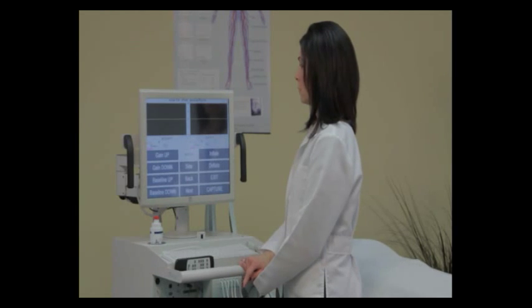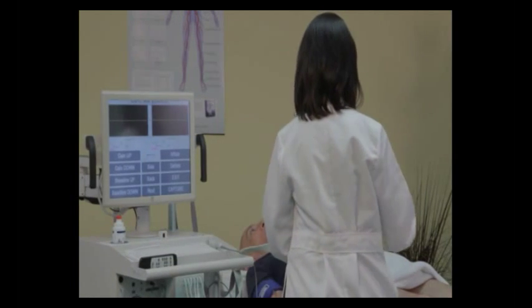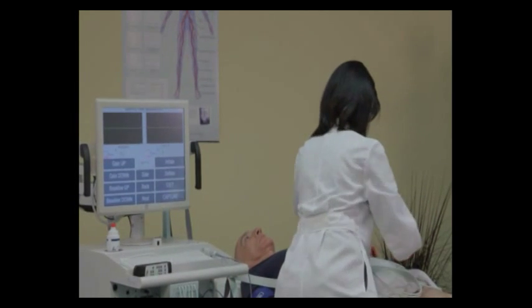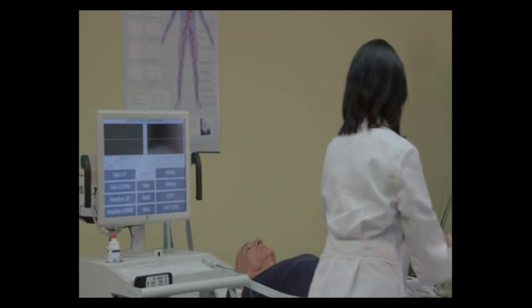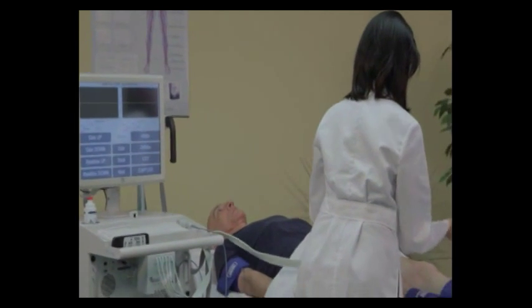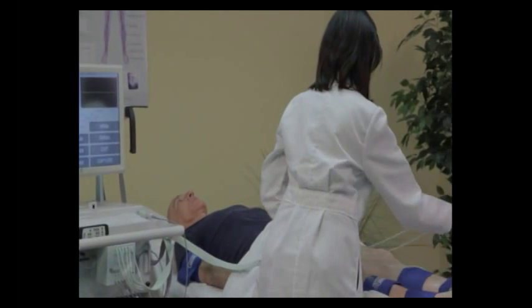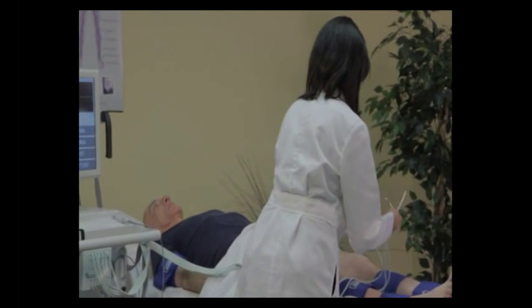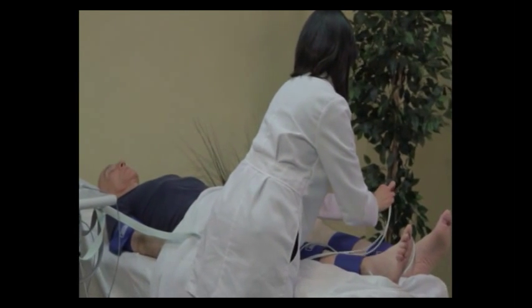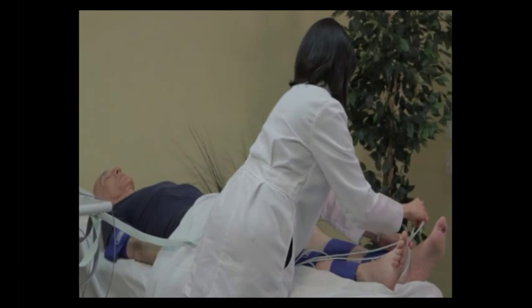We're also going to show how to hook up the hoses to the cuffs. Now it's important to note that when you're attaching the cuff inlet tube to the hose on your multi-lab, you will notice it is a friction fit. These are called luer fittings, and they are a simple press fit. Many people make the mistake of pressing them in too firmly, thinking they might leak. This will make them difficult to remove after your examination.